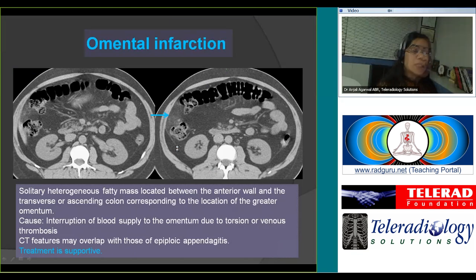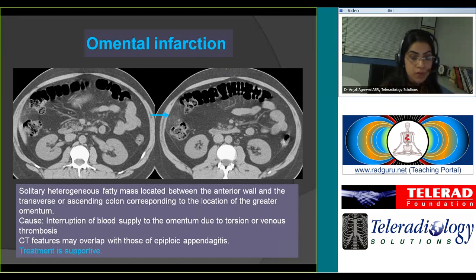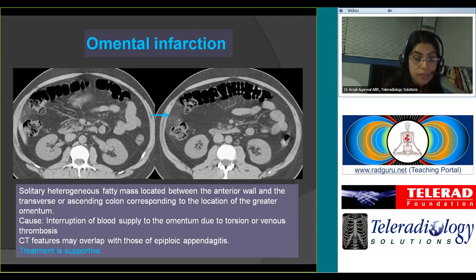A similar but different condition is omental infarction, where you see solitary, ill-defined areas of fat stranding — usually a mass-like heterogeneous fat between the anterior wall and the transverse or ascending colon, corresponding to the location of the greater omentum. The infarction is caused by interruption of blood supply due to torsion or venous thrombosis. Treatment is supportive, and correct diagnosis prevents unnecessary surgery.